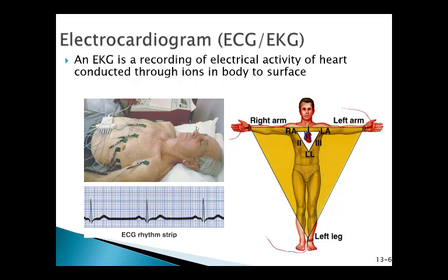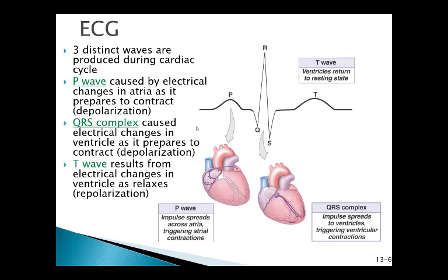In order to measure the electrical activity that is happening in the heart, an EKG can be done. When we examine the electrocardiograms from a healthy individual, we're going to see a series of telltale waveforms that is referred to as sinus rhythm. Each element of the waveform has been identified with a letter identifier. So we have our P wave, a QRS complex, and a T wave.